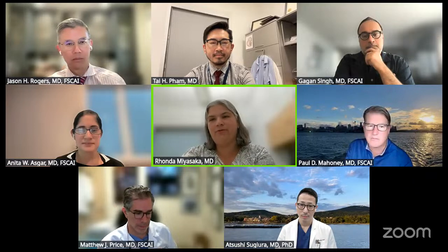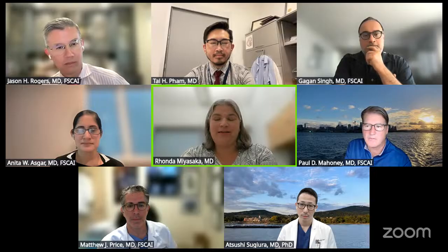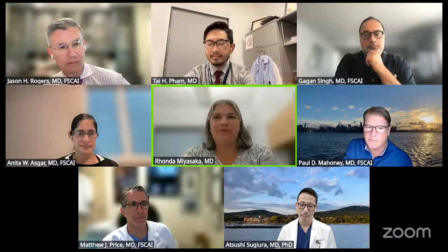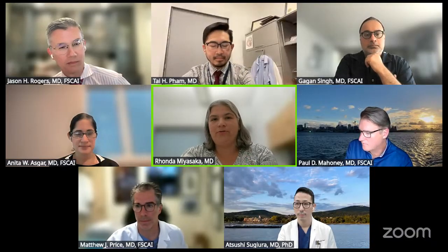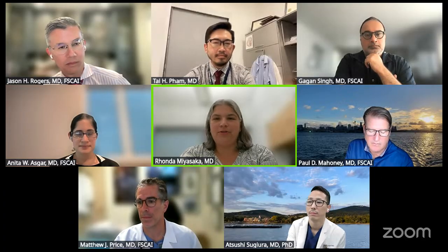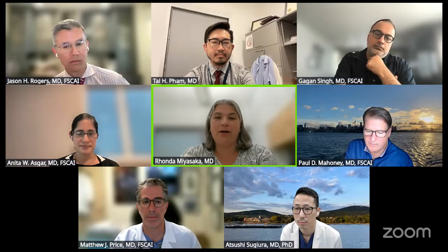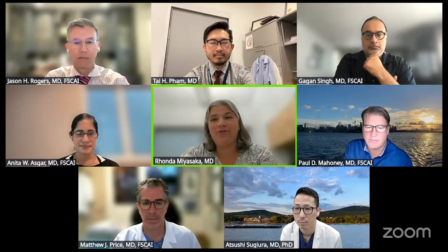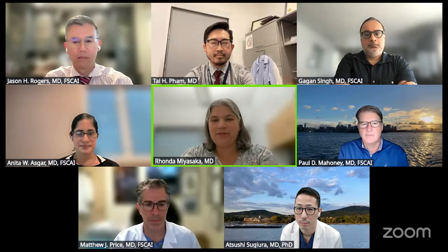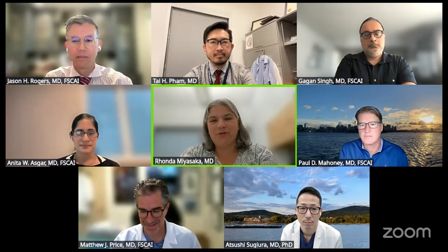And the other thing that's really important with tricuspid imaging is just evaluating all of your imaging windows at the start of the case. So the first thing that I'll do, whether it's a screening TEE or intraprocedural, is look at your mid-esophageal, your deep esophageal, your gastric, your deep gastric. You're going to try to figure out what your options are. Even if you have good imaging at the start of the case, once the TriClip system is in the right atrium, all of the imaging can change. And so having that flexibility is really important.